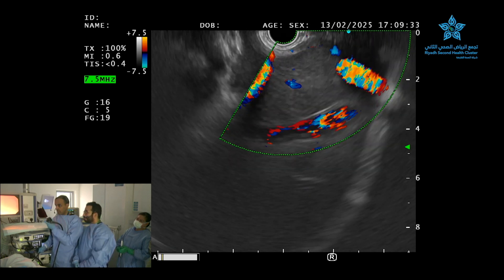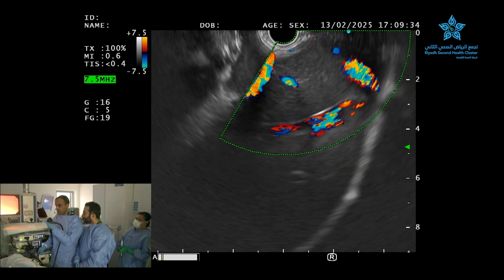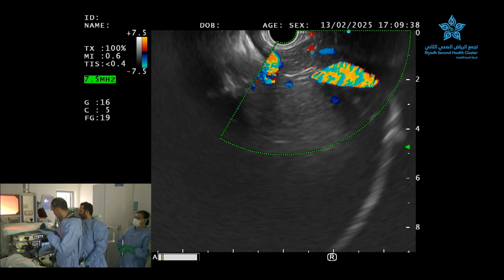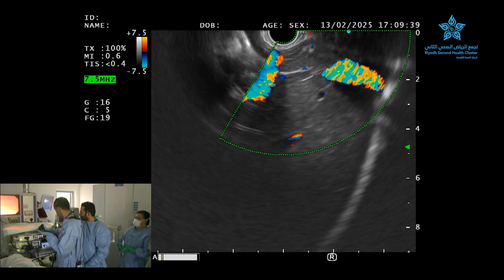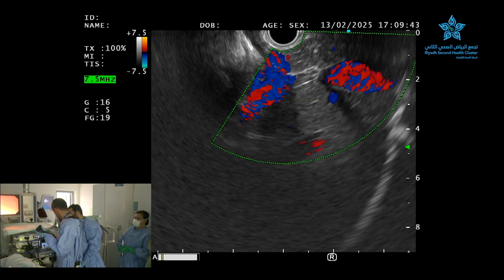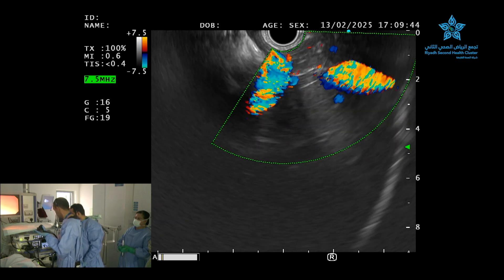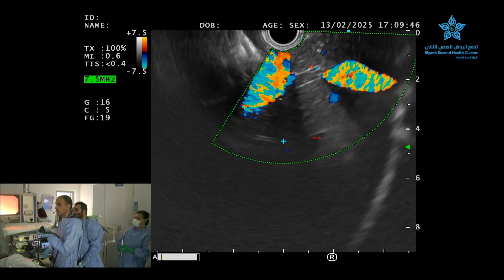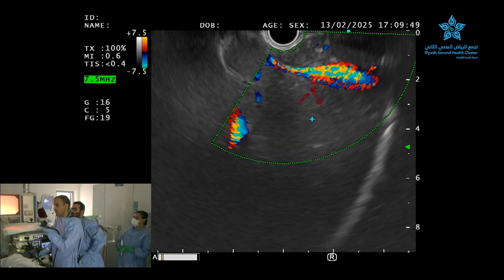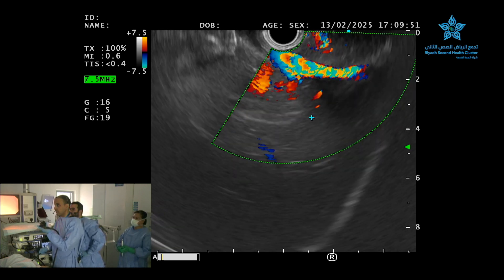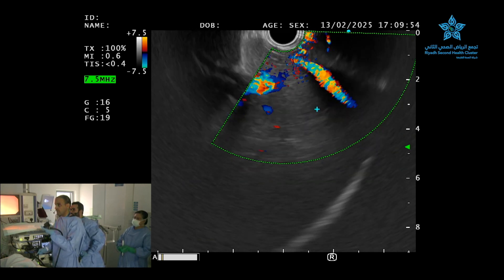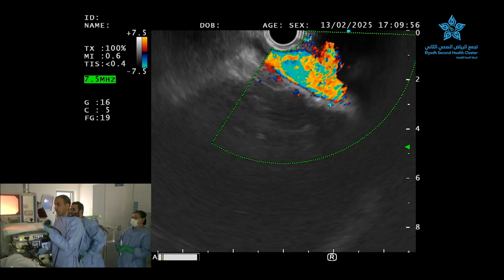Adil, can you use the cursor, please? So I'm just going to put it here. Nawaf, we can go back a little bit more clockwise. Nawaf is now going towards the heart just to show the anatomy here.